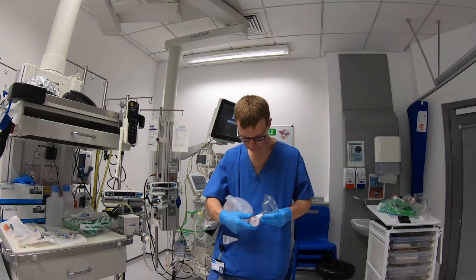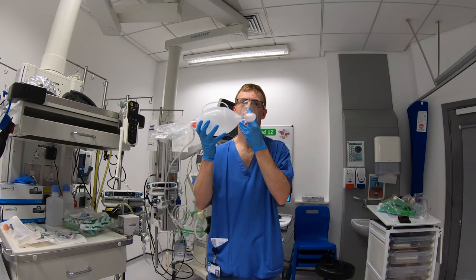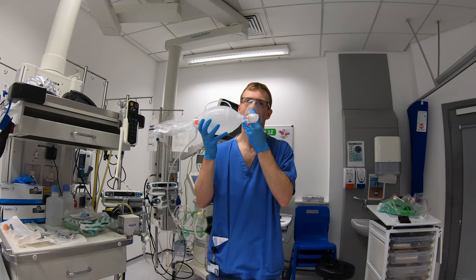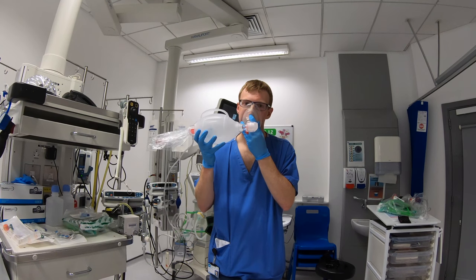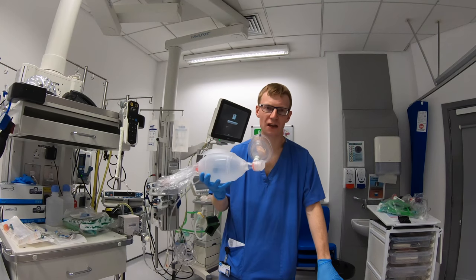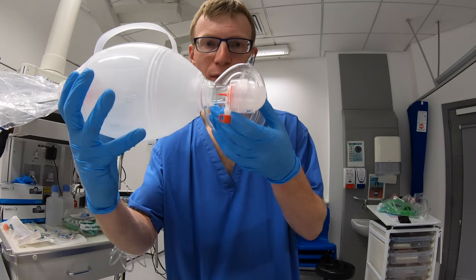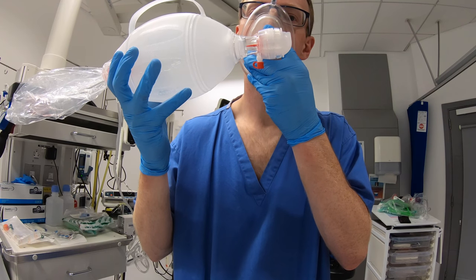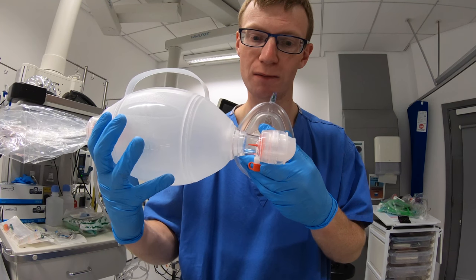I'm going to put the bag valve mask on and see how easy it is to breathe through the mask. So I think you can hear the noise coming from this. There's actually quite a bit of sucking in, and quite a bit of work of breathing I'm having to do to breathe through this bag valve mask. I'll give you a close-up view of me trying to move the valve. So after three or four breaths, I'm exhausted breathing through this bag valve mask.